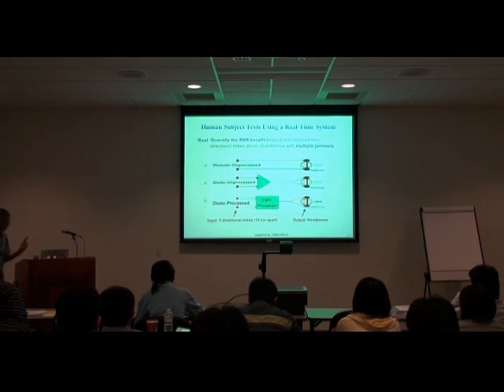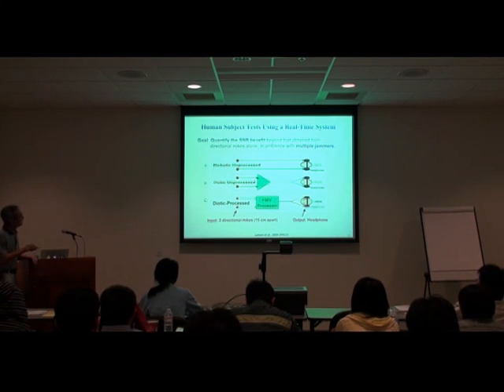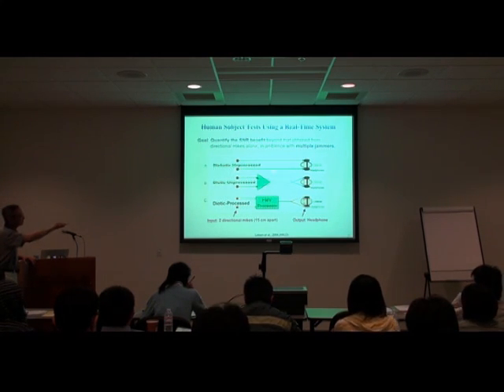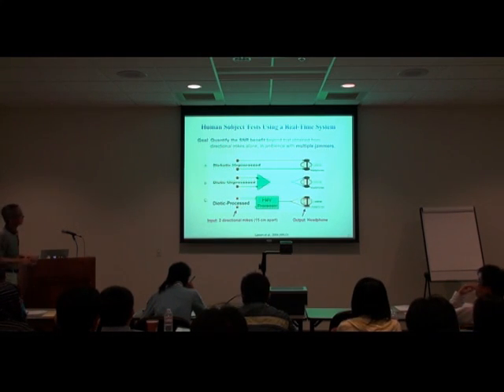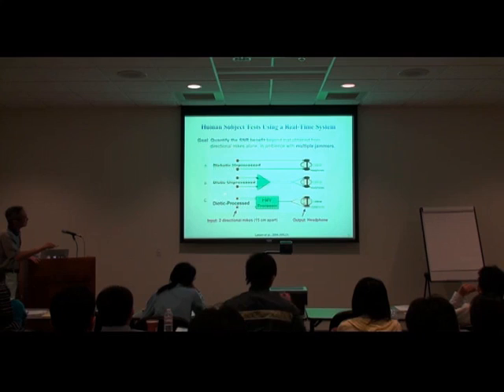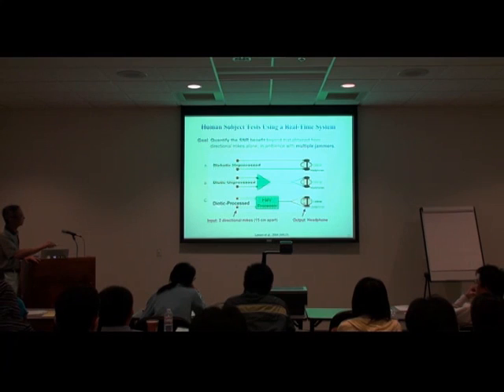And so we now have to perform several tests to really see whether the real-time system works at all. The input really is 2 signals separately. If it's unprocessed, then you can feed the output of 1 microphone to 1 ear, 1 headphone, the other to the other headphone. That is the unprocessed signal. We can see whether or not the ear can process the signal well. And the final scheme is this one.